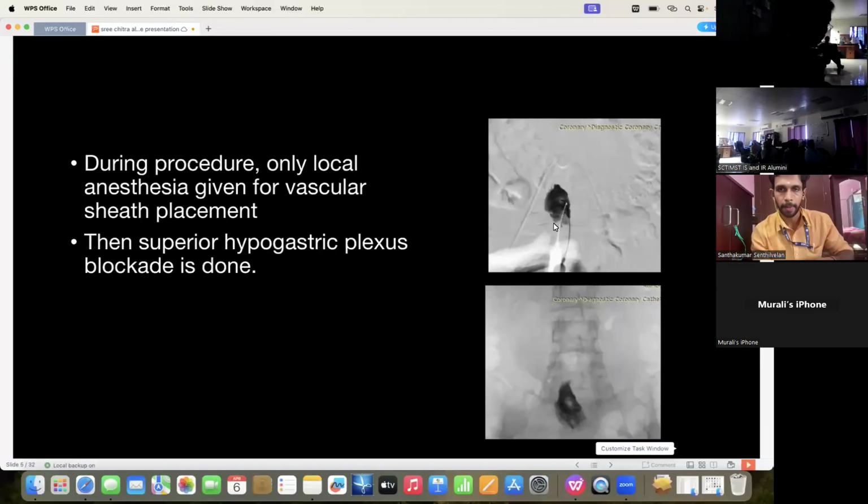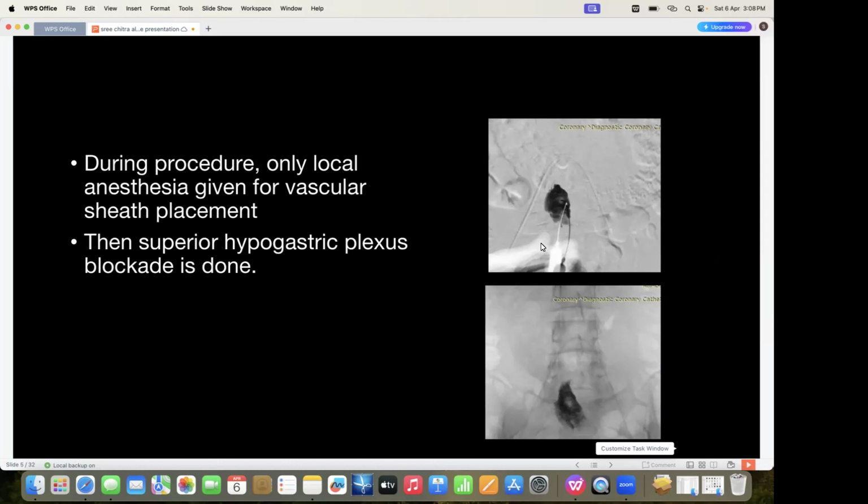Opacification. Usually when there is some vascular opacification, we will see a linear structure from this extraperitoneal contrast going. So once after confirming that there are no vessels in the way, we will be giving 20 ml of 0.5% bupivacaine, which will be injected through the same Chiba needle.